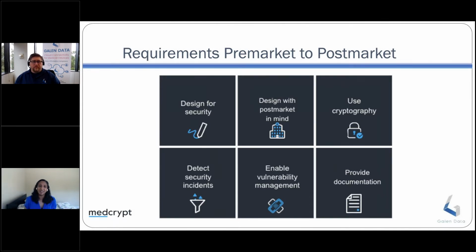It doesn't work in hospitals that aren't going to replace a device just because it's a couple years past when it was supposed to work. If it works just fine, that thing persists. So you have these very specific requirements that are due to the healthcare use case. We'll talk through each of these in a little bit of detail here, and hopefully folks can ask questions as we go through it if they are unclear on what it means.